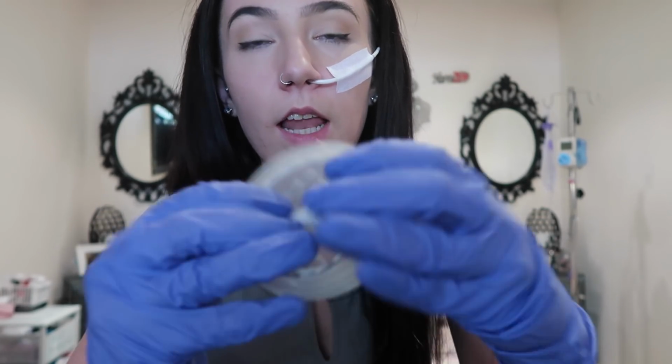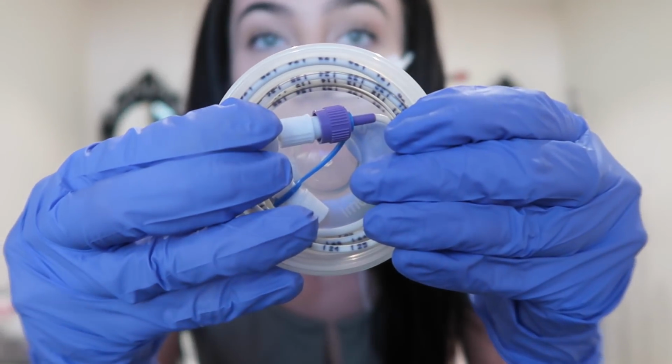We're going to pop it in like that, and then we're just going to pop the lid on. Okay, so now that it's in its container, we don't need these gloves anymore. We can take those off because that is a sterile environment, so I can touch the outside of this, it's fine. It's just keeping it in a safe place now where it's not going to get any moisture in there or anything like that. But that is pretty much ready to go for next time I want to place my tube.